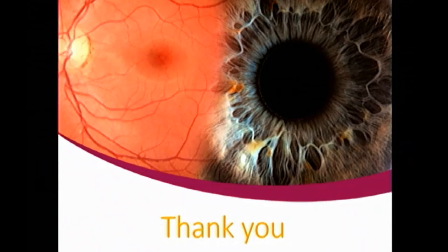Yeah, but when you have white dot syndromes, this is common. Why I called it white dot syndromes, first of all, is because this is only a descriptive term based on the fluorescein angiography. When you have such a finding in the fluorescein angiography, you can go with multifocal choroiditis. Usually they have early hypo and late hyper. And when you have, in addition to that, panuveitis or subretinal fibrosis, we call it multifocal choroiditis plus panuveitis.